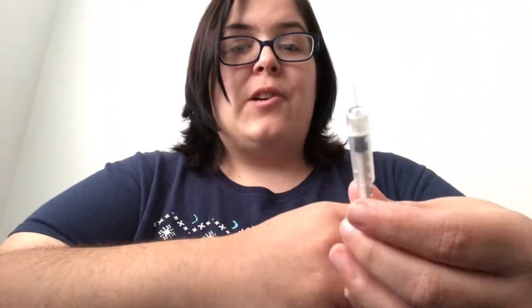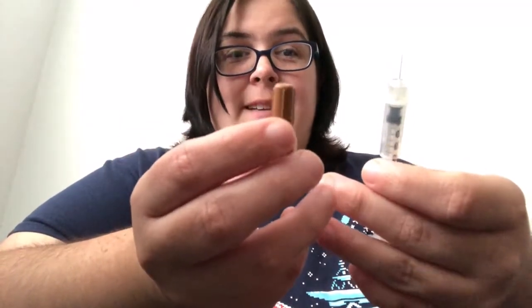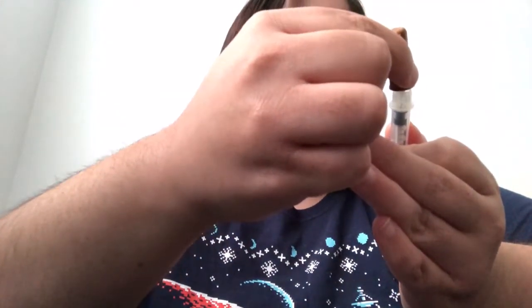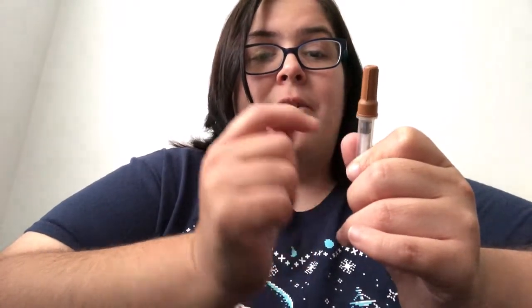Okay, sorry, my phone was falling. But here's the tuberculin needle, and this is what she was doing. You will learn very quickly in nursing school never to recap a needle. They have caps on them, which are very tempting to use, but she was doing one of those numbers where she went like this, but she wasn't paying attention, and she missed putting the cap on the needle and stuck herself. That is why you should never do that.